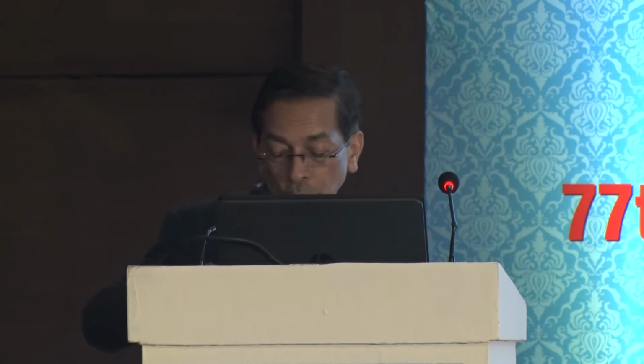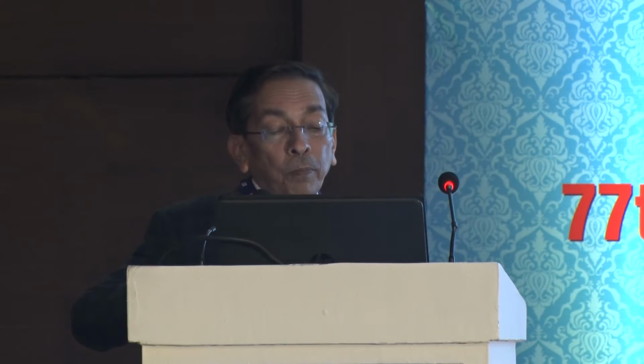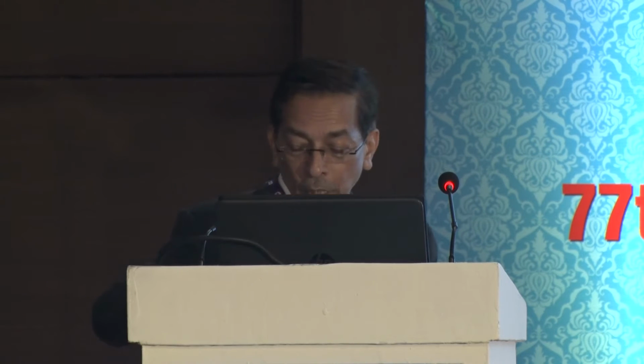iTrace showed that it was rotated by 1.81, and thinking that there might be some fibrosis and tilting of the lens, we tried to rotate this lens, and later on the vision improved. And you can see that the total aberration is gone at 1 mm, 2 mm, and 4 mm.